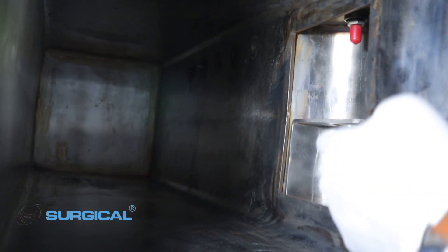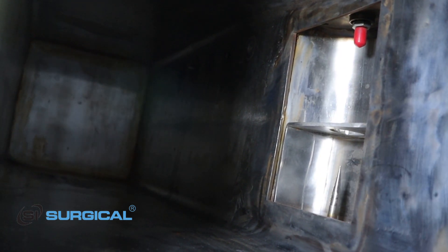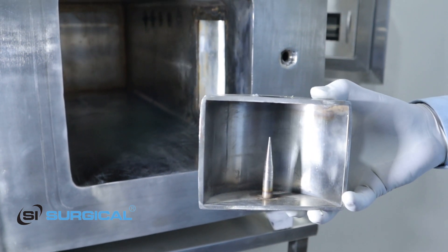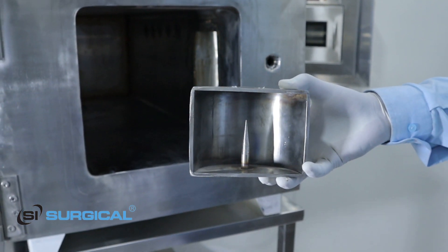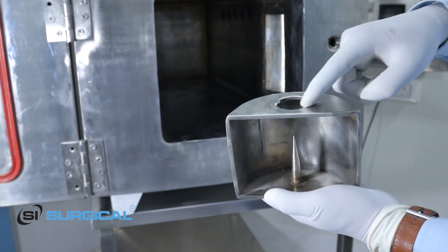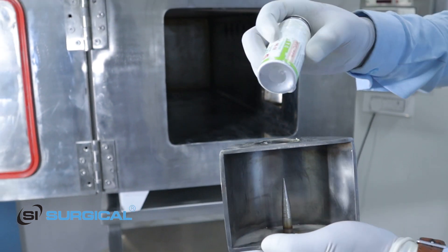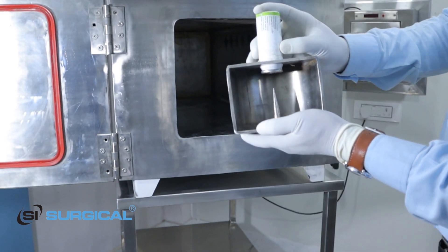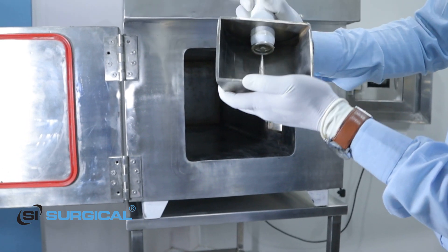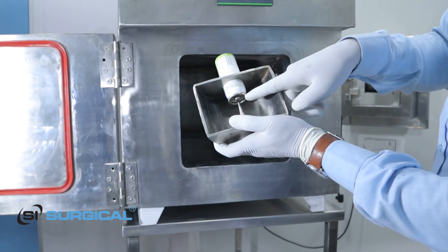This is our ETO cartridge holder where we can place our EO cartridge for EO punching. This is our EO cartridge holder — here we have to place our EO cartridge. This is our EO cartridge and we have to place it right here. You can see there is a pin that will hit this cartridge and puncture it.